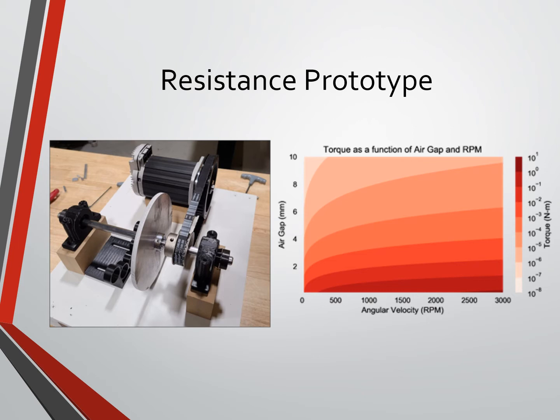We were also able to leverage the Scheiber model information and our own experimental data to construct a mathematical model that we used to construct our control system algorithm.